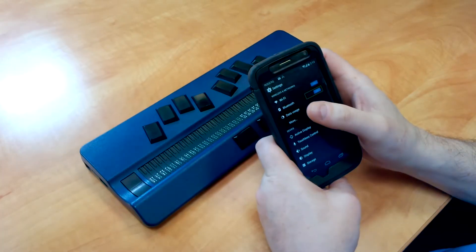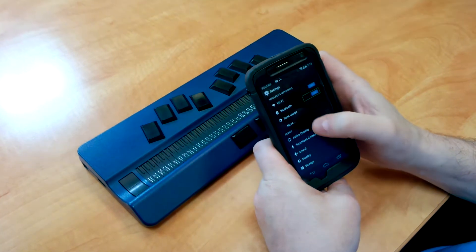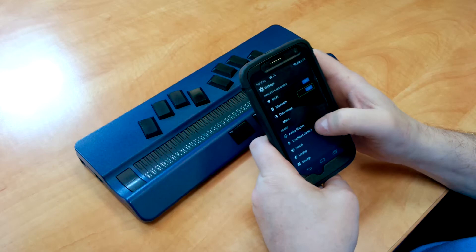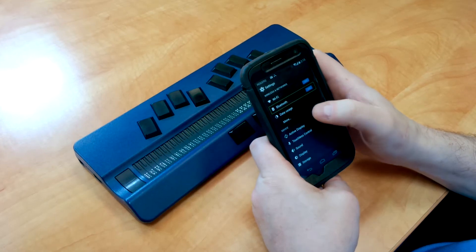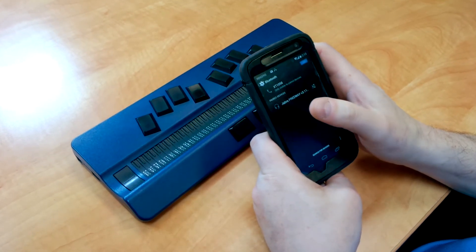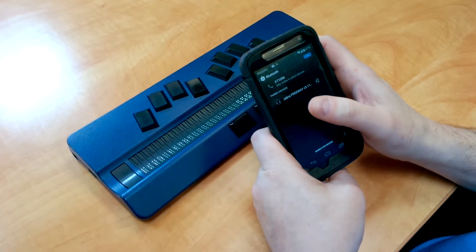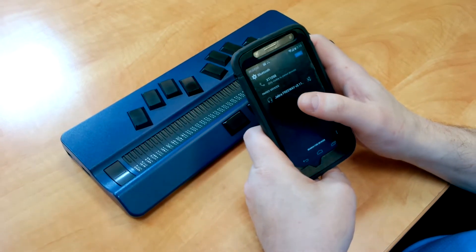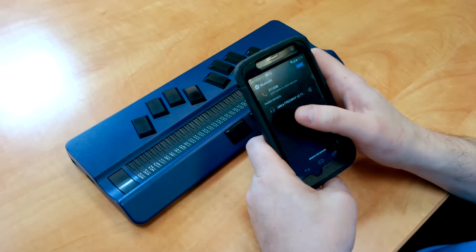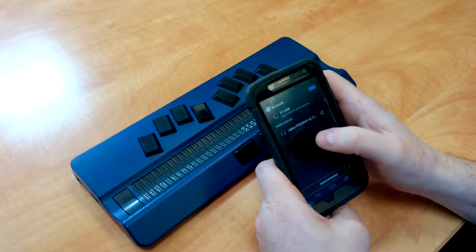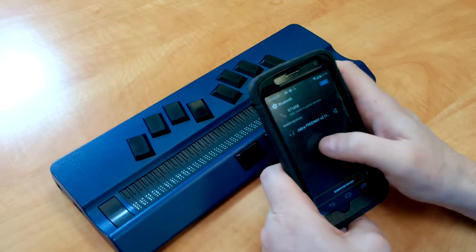When we left off, we had Bluetooth On on our device, so I'm going to swipe up the Bluetooth and double tap. Bluetooth. Showing Items 1 to 3 of 3. I'm going to go down to Search for Devices. Search for Devices. And double tap.